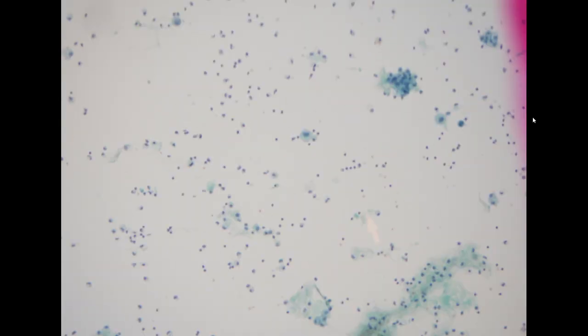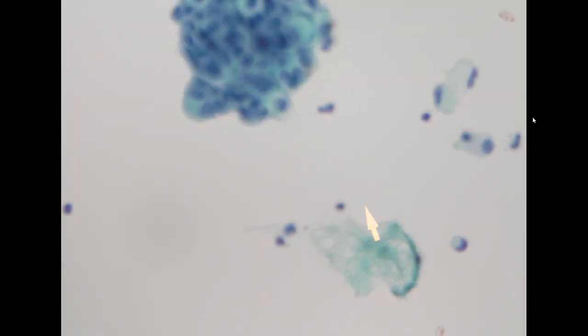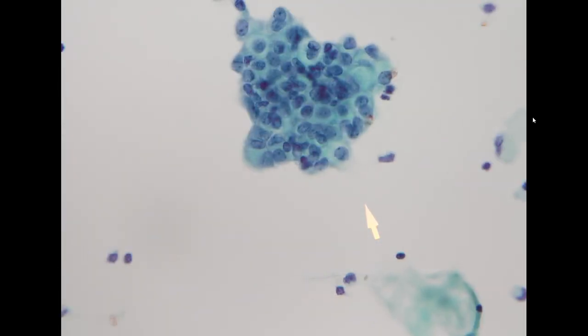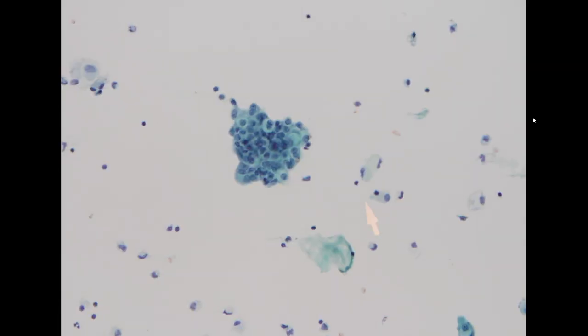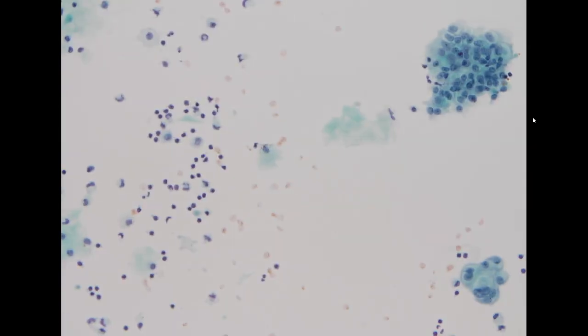I would favor this is likely reactive mesothelial cells instead of carcinoma, especially since the patient had hepatocellular carcinoma, but it doesn't look like a hepatocellular carcinoma. So it was sent out as positive for carcinoma, but we really need to do some ancillary tests to confirm.